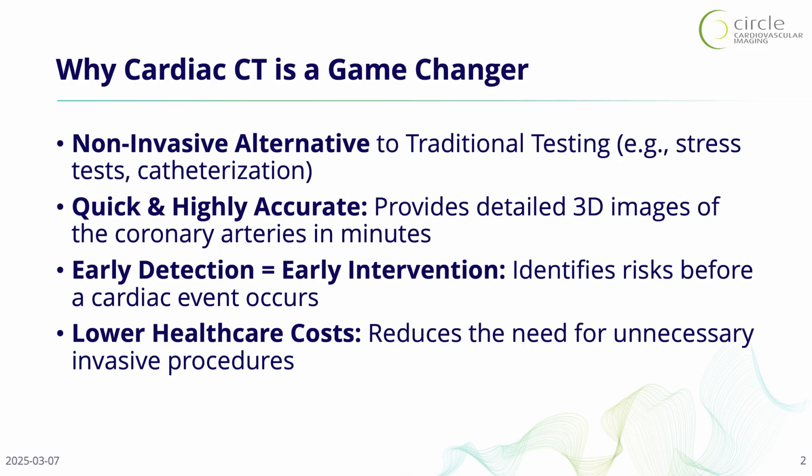Again, you saw how quickly and accurately these detailed 3D images of the coronary arteries can be seen, within minutes. And kind of demystifying that so that we can see that primary care can control some of this information as well.